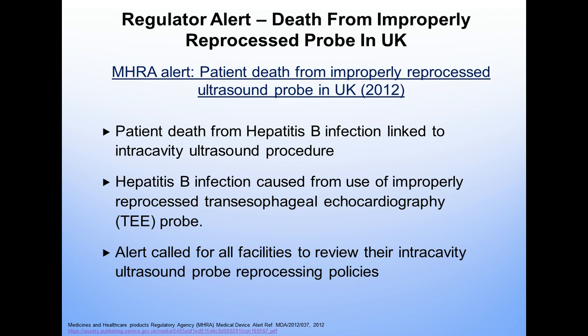And I just wanted to mention one. John may mention some a little bit later, but certainly in the UK, there was a death from an improperly reprocessed probe. That was in 2012, and it was due to hepatitis B transmission linked to an intracavity ultrasound procedure. So hepatitis B infection was caused because of improperly reprocessed TEE probes, or a probe.